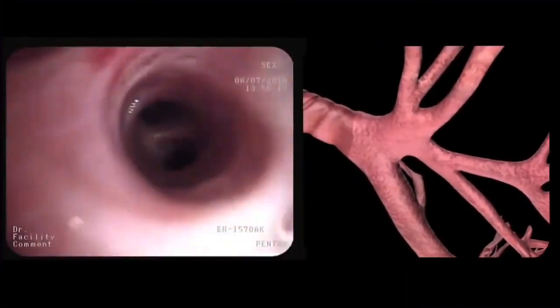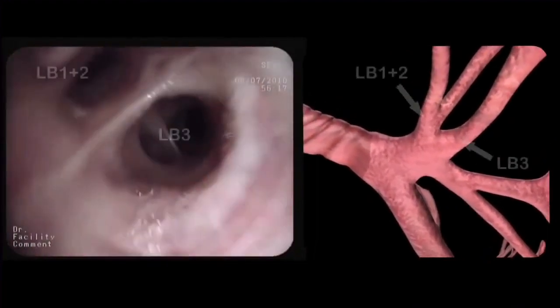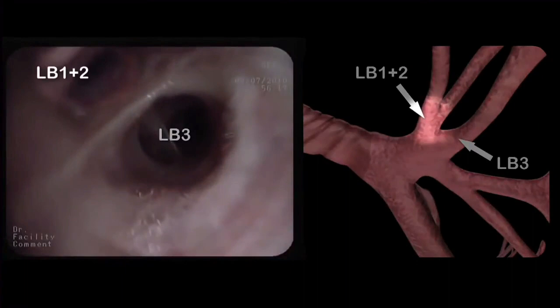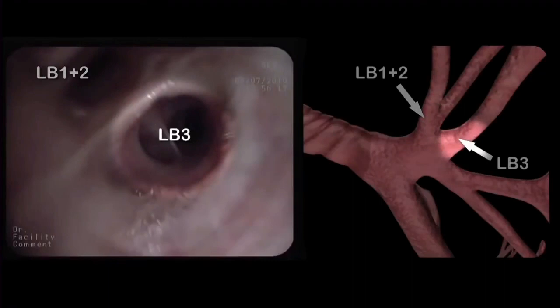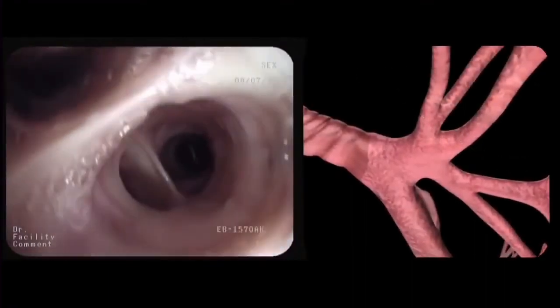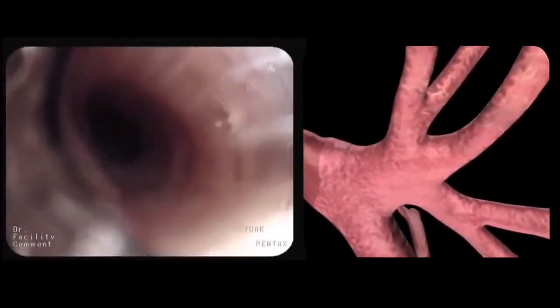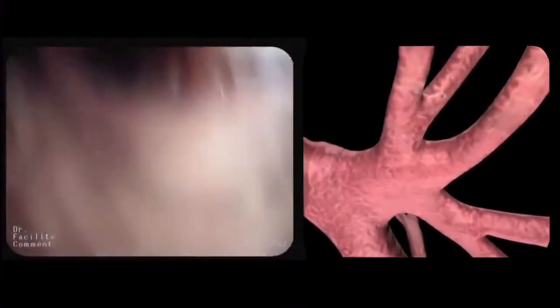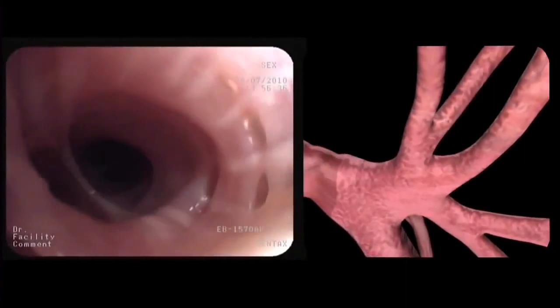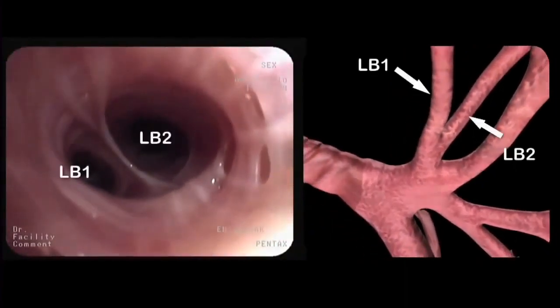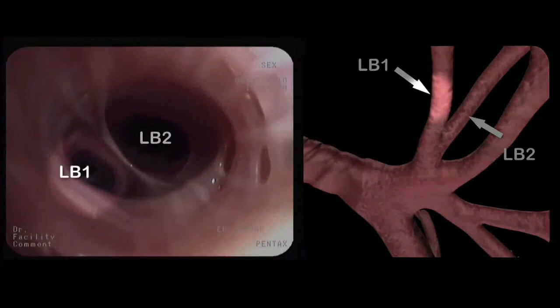The bronchoscope is retracted and advanced into the upper division bronchus. Here we can identify the apical posterior segmental bronchus or LB1 plus 2, and the anterior segmental bronchus or LB3. LB1 plus 2 is often difficult to inspect because of its steep angle. Once the bronchoscope is positioned well, we can see the apical bronchus or LB1, and the posterior bronchus or LB2.